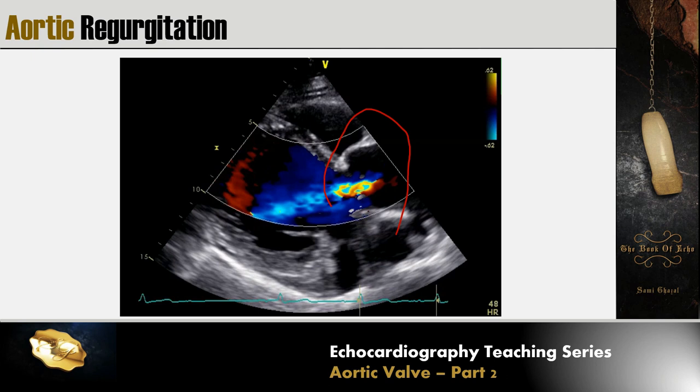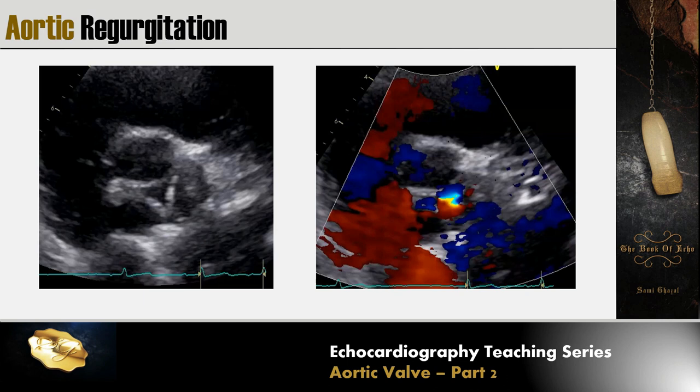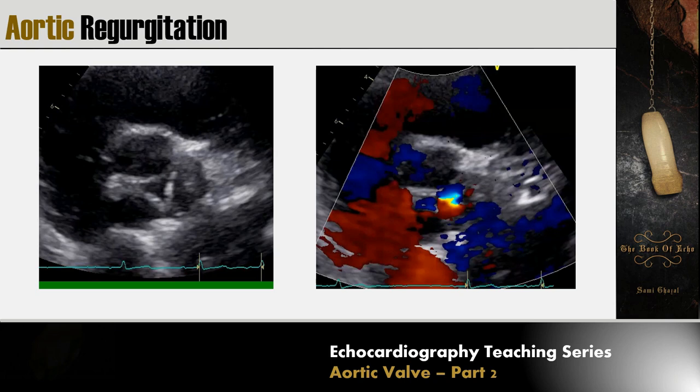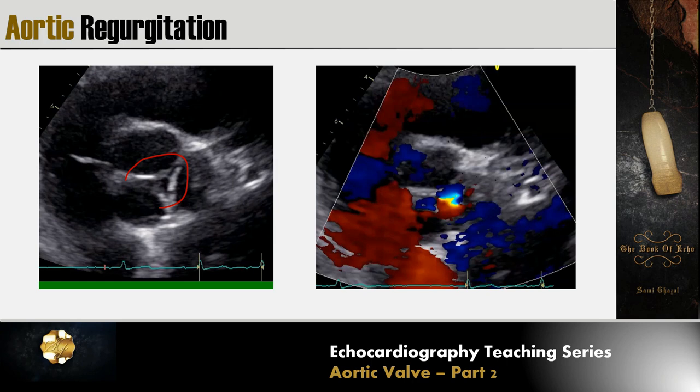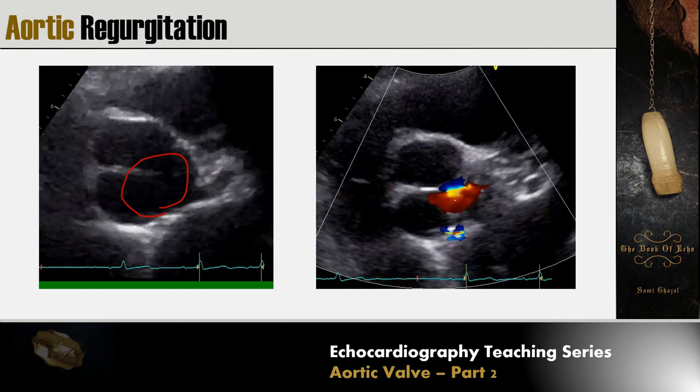In the case of aortic root dilatation, if we look at the aortic valve in short axis, we will see a central coaptation defect. When we run the image, we can see the aortic regurgitation jet coming from that defect.